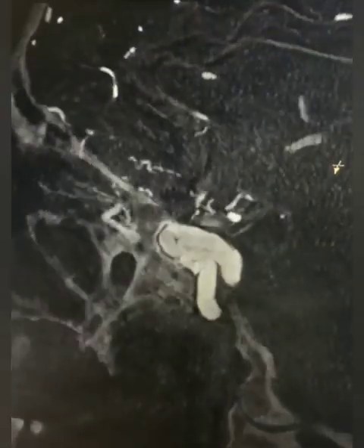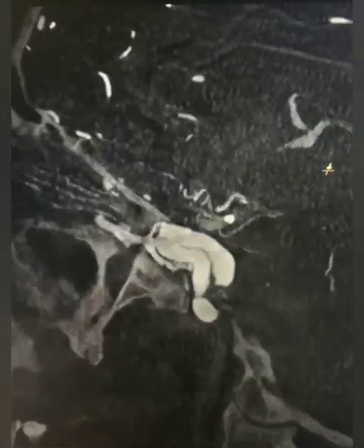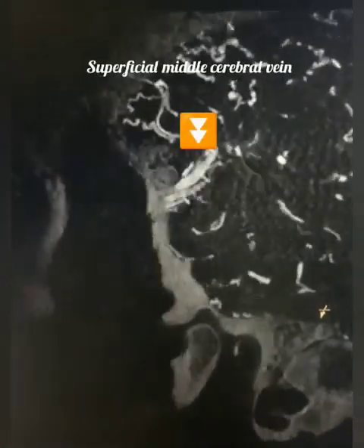A patient with direct CCF, on expert CT angiography, one can visualize the exact site of the fistula. The venous drainage is anteriorly into both the superior and inferior ophthalmic veins, as well as drainage into the superficial middle cerebral vein, causing significant cerebral venous congestion.